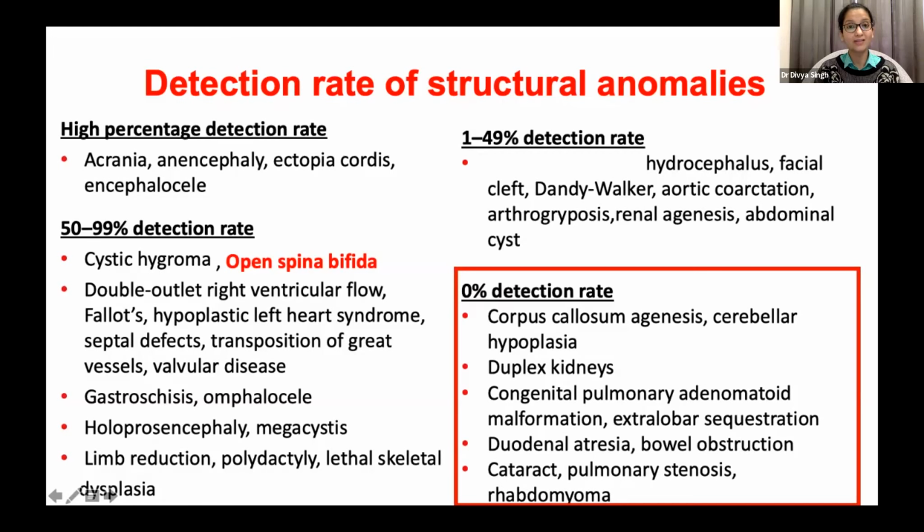And this is because certain new signs have come up for detection of this condition. Also, alobar holoprosencephaly, body stalk anomaly, and abdominal wall defects also figure in this nearly 100% detectable group now. So it's important to keep pace with the changing times. There are certain anomalies which are hard to detect or nearly undetectable at this time.